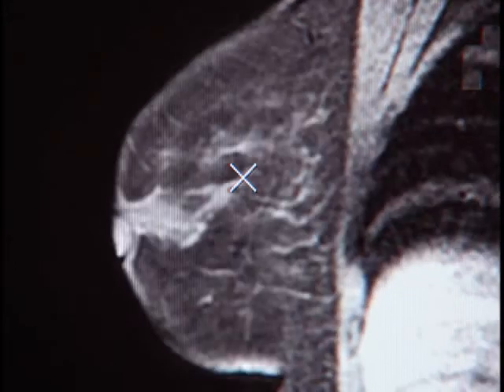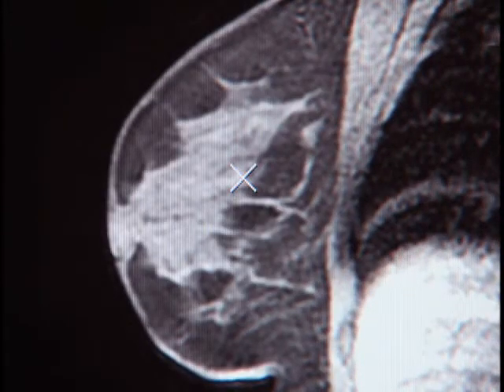First, navigate to the grid to make sure that your lesion is accessible within your grid. As you can see here, the deepest portion of the grid is here. We are within an accessible region. Next, again, navigate to your lesion and note the slice depth of your lesion.